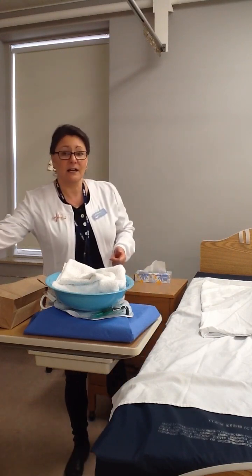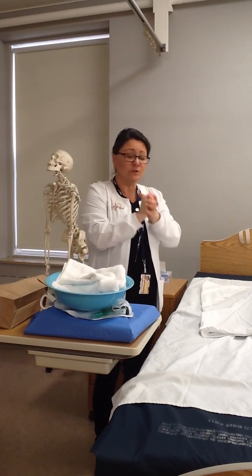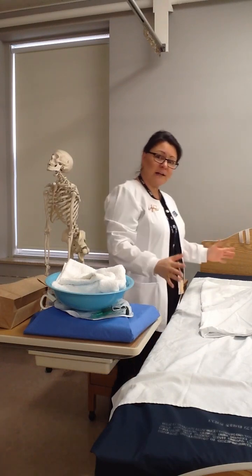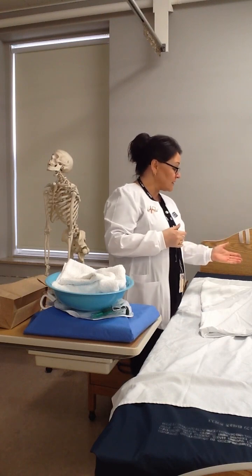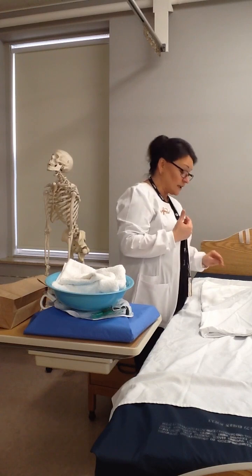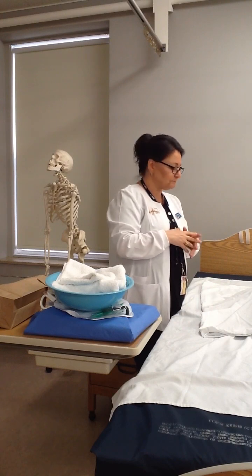So as I enter my patient's room, I do hand hygiene in front of my patient. That is so important. And then I'm going to identify myself and say, hi, my name is June and I'm going to be your nurse today. And I want you to envision that there is a whole body here, a head and arms and legs, and not just some genitalia for us to insert a catheter. So I'm going to ask Jesse to please tell me his full name and his date of birth. And when he repeats that back to me, I'm going to confirm that by looking at the name band on the patient's wrist. It's absolutely essential that you identify your patient.